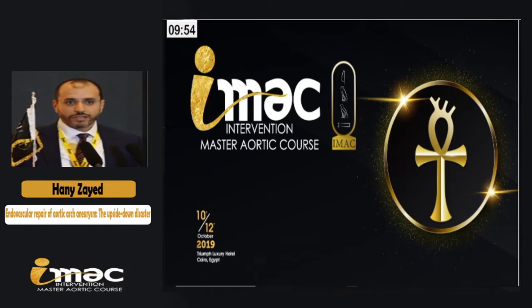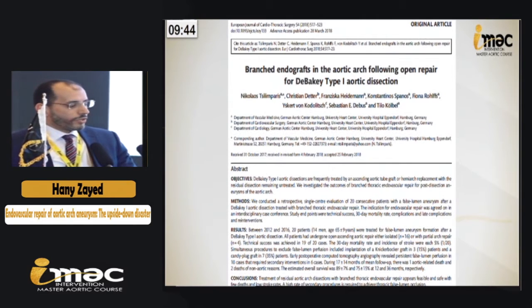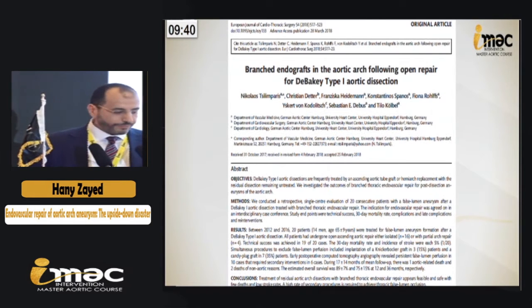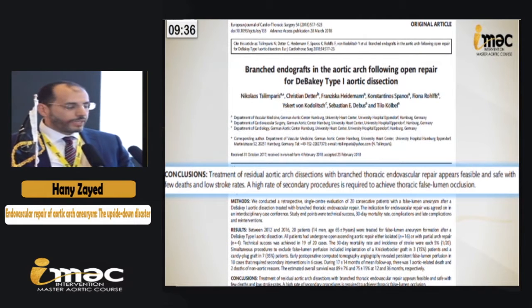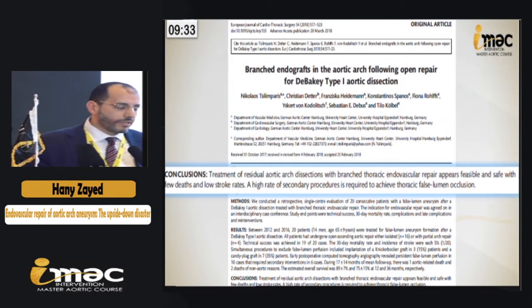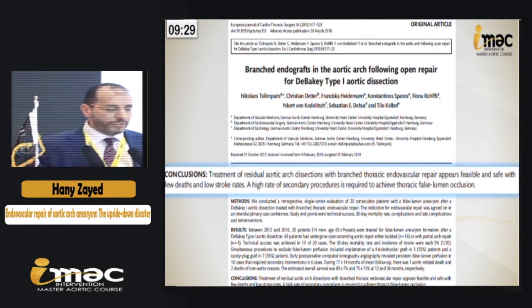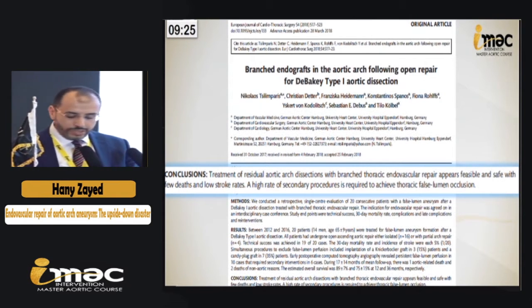I'm afraid this is another one of the catastrophic cases. Endovascular branch grafts are increasingly used to treat aortic arch pathology. This is a paper from Dr. Kobel's group who reported their 20 cases of treating arch pathologies. They concluded that this is a procedure with acceptable risks and mortality, with a low stroke rate as well.